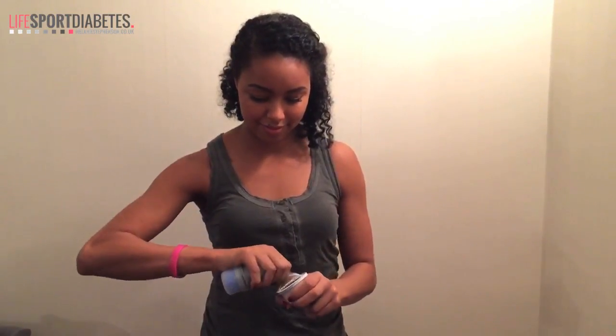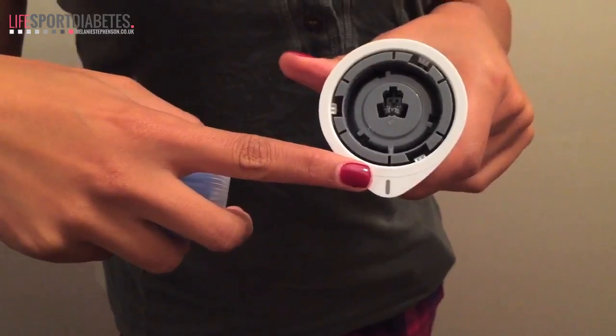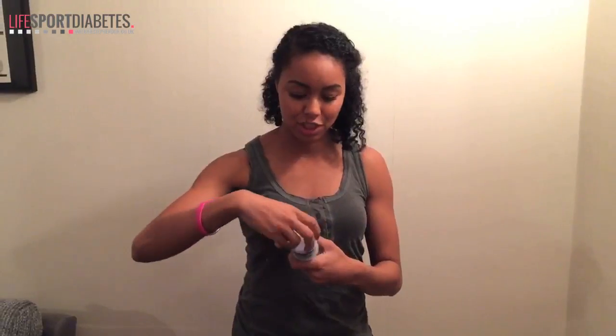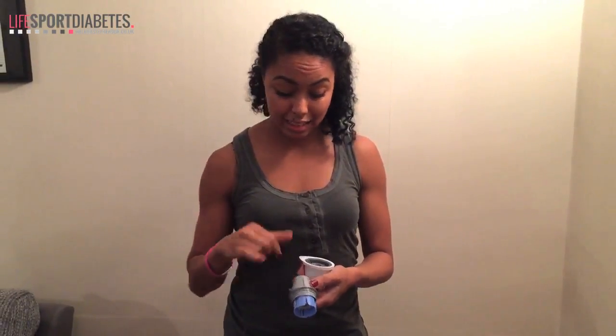Next I'm going to be attaching the sensor pack to the applicator — only two pieces, really easy. Once that's open you can just see the mark there that I need to line up the applicator with. So you just unscrew the applicator device and pop the lid to one side. You can also see there's a black marker line that needs to be lined up with a black marker on the sensor itself.